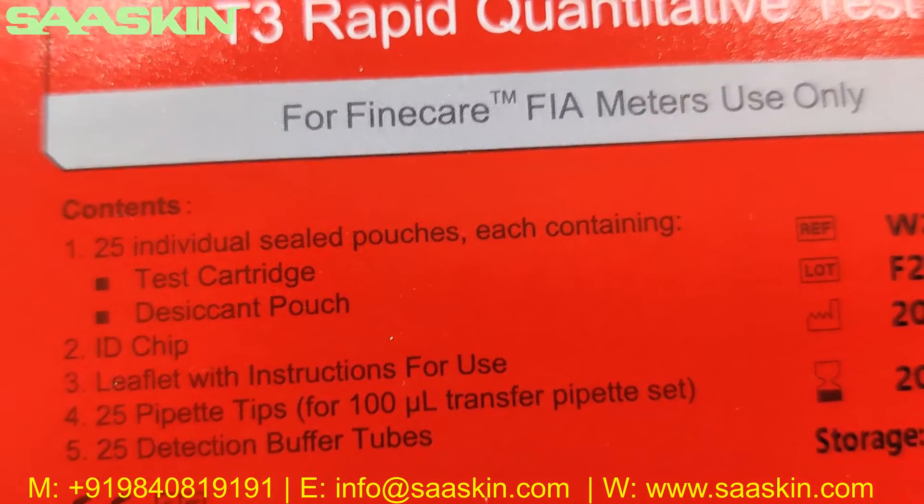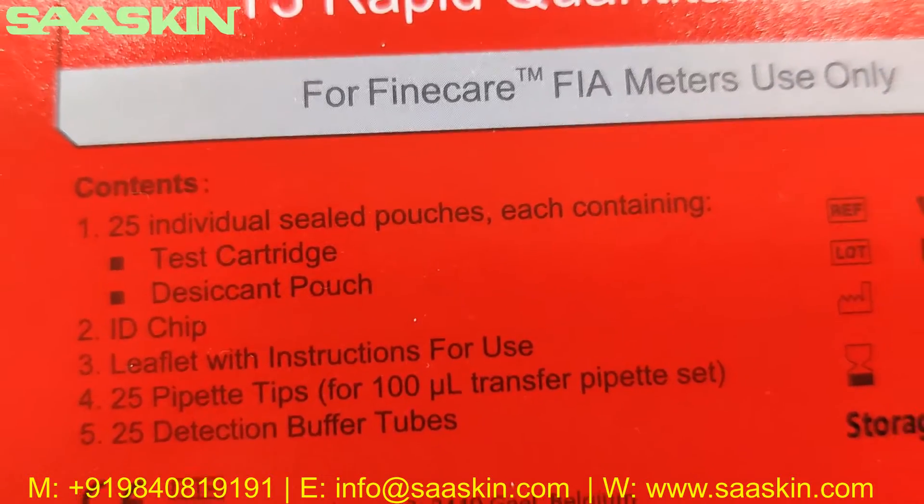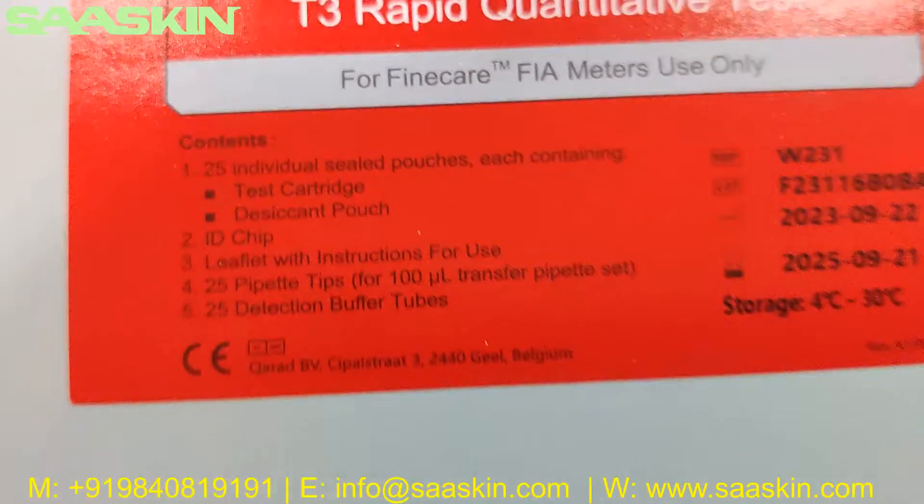On a standard you have 25 individual sealed pouches, one ID chip, and a leaflet with instructions, 25 pipette tips, and 25 buffer tubes.